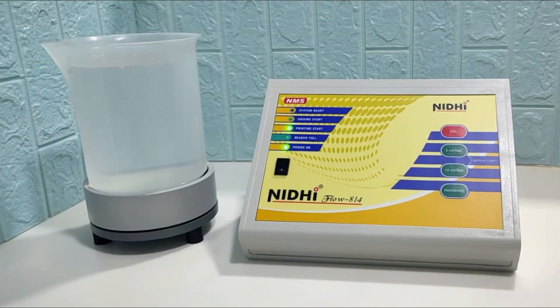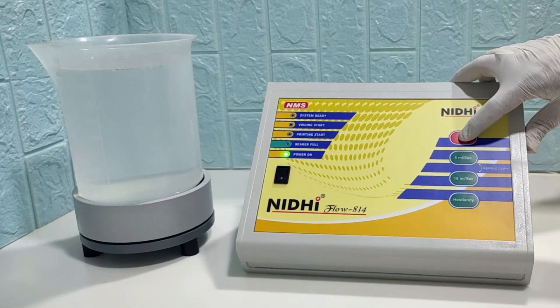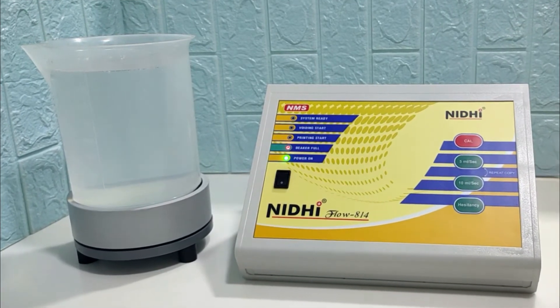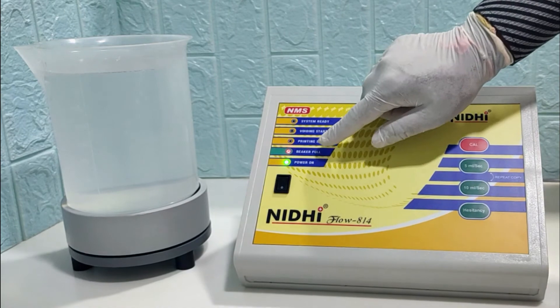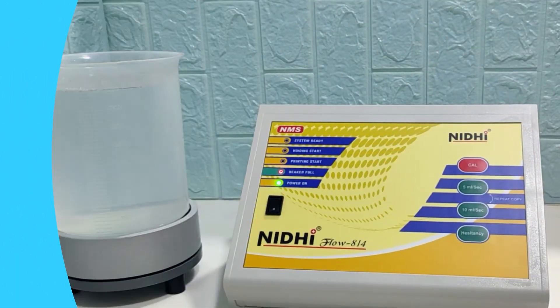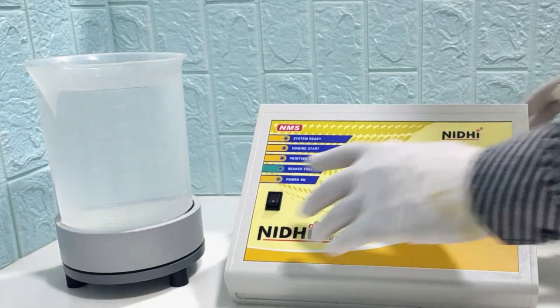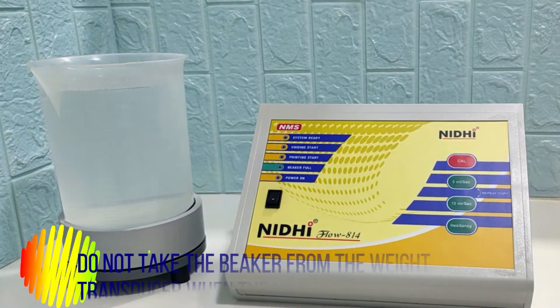Press the calibration switch again and the beaker full LED will glow. Then switch off the module.